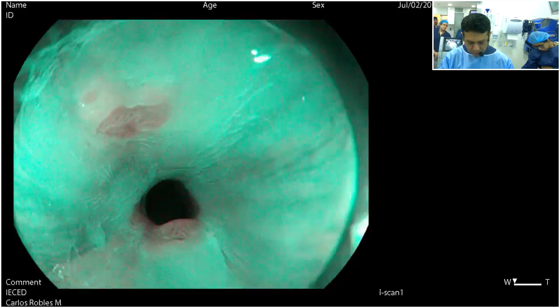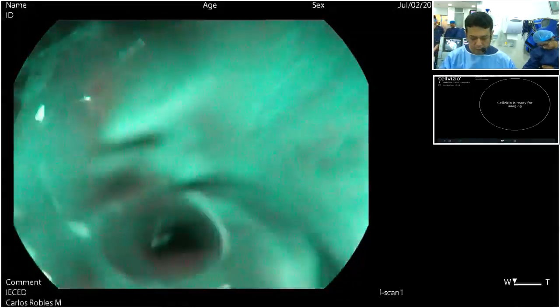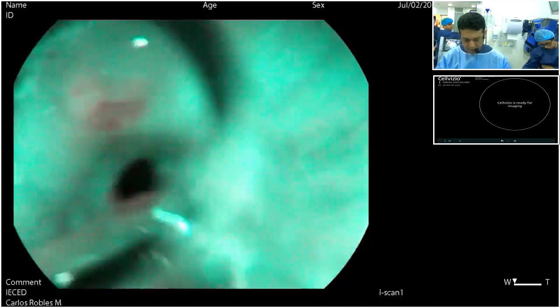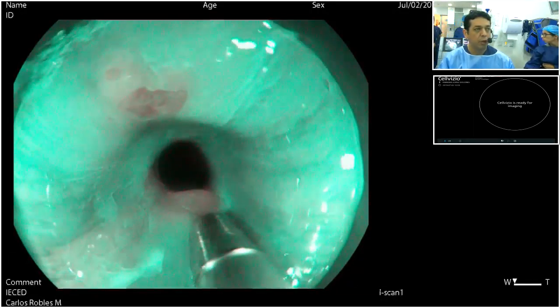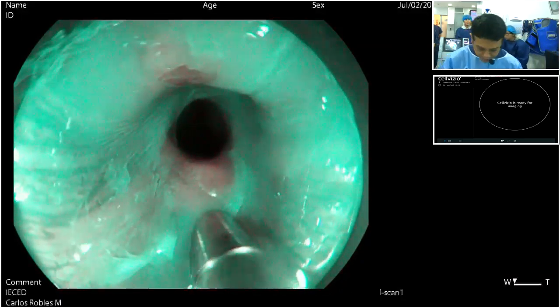So confocal laser endomicroscopy gives us a vision of 1000 times increase in the optical. So we need to use fluorescein also to see the cells.